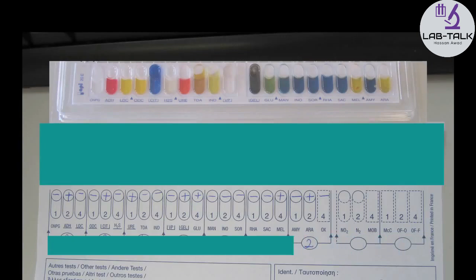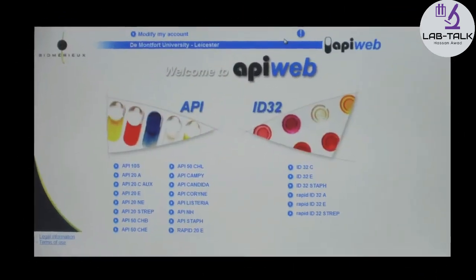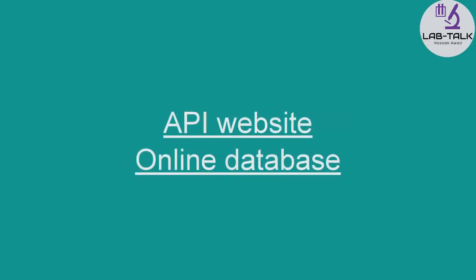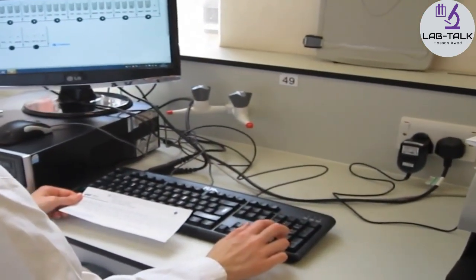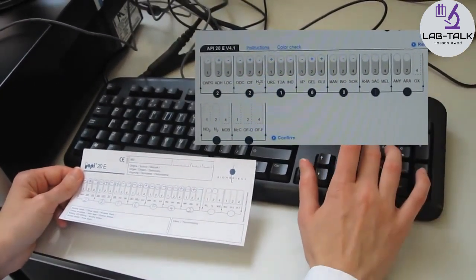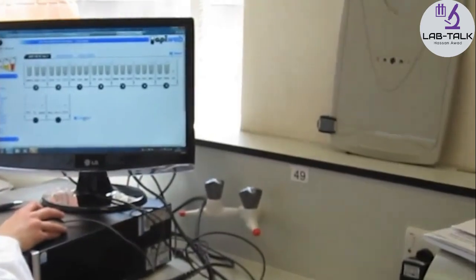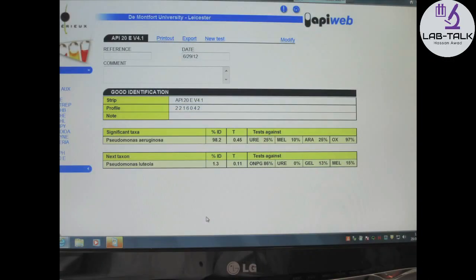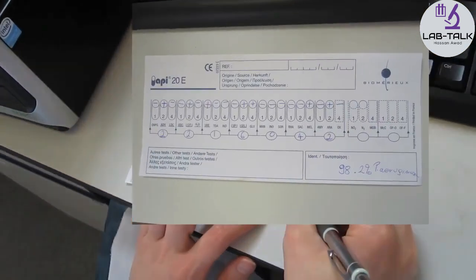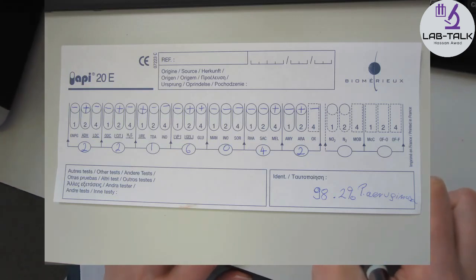The final seven-digit profile number may be used to identify the unknown micro-organism. This may be performed by using the online database available on the API website. On the website, an electronic version of the result sheet is visible. The seven-digit profile number is typed into the appropriate circles and the confirm button is pressed to search the database. Possible identification results then appear on the website. The profile number 2216042 identified the unknown bacteria as Pseudomonas aeruginosa with 98.2% discrimination.